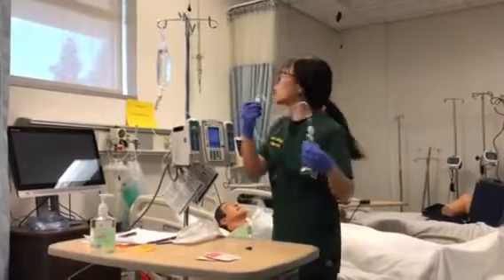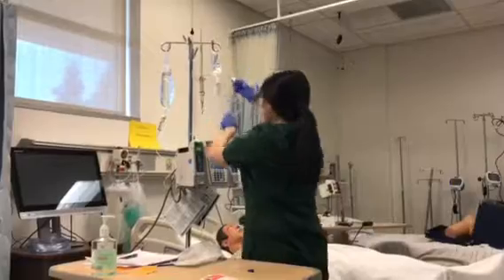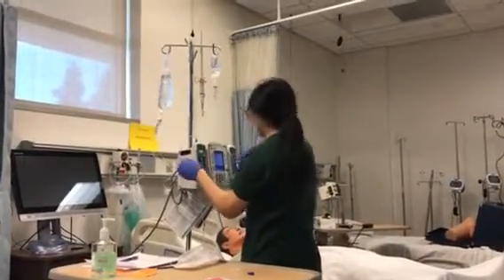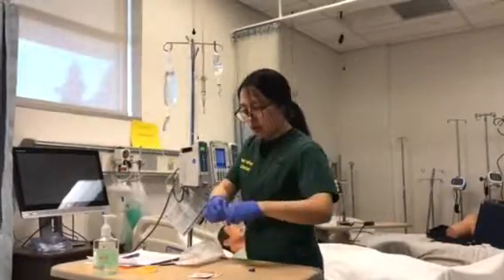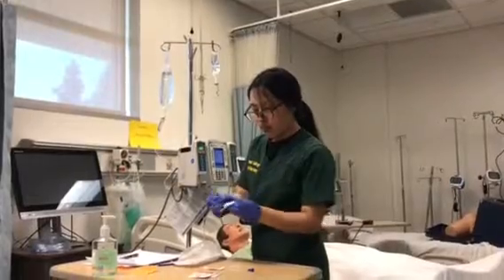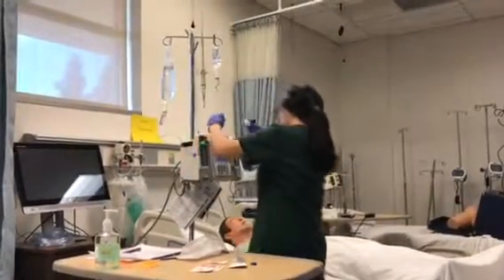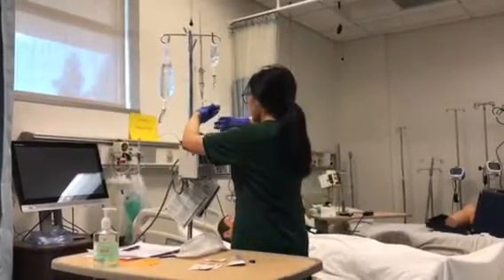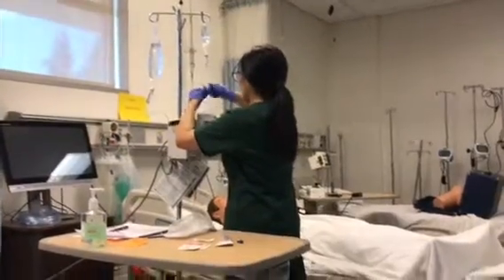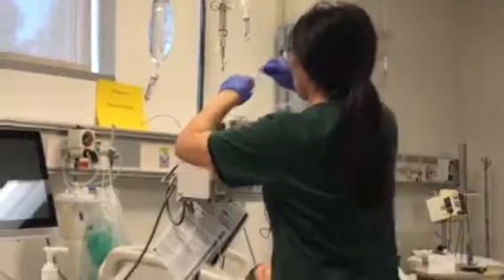So this one is closed. I go ahead and hang it here. Get it ready. Then I will pass the primary bag. After this, get an alcohol swab. Here, get the secondary ready. Go ahead and remove the secondary cap. Connect these two.